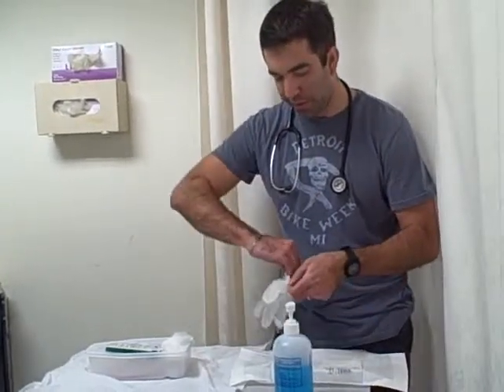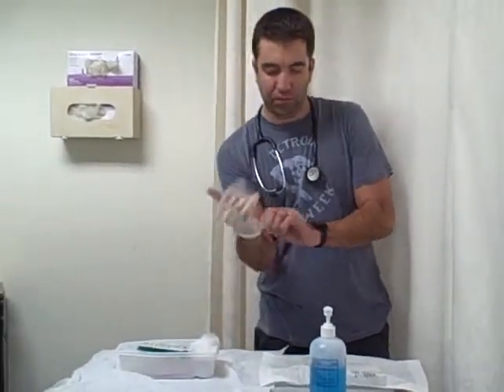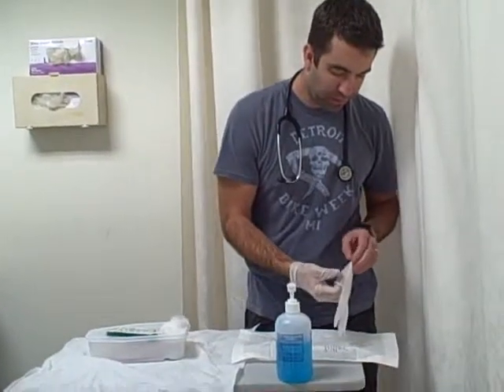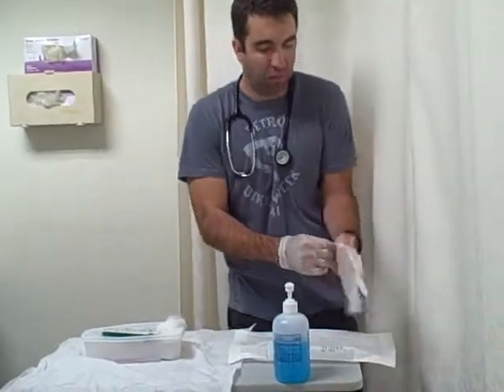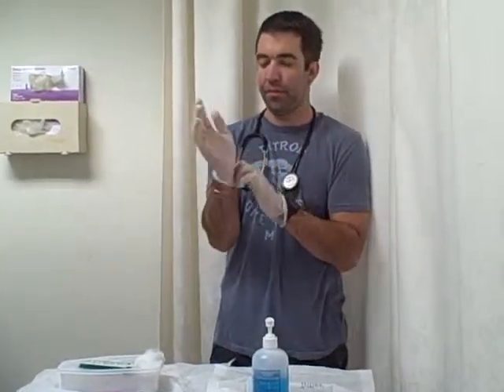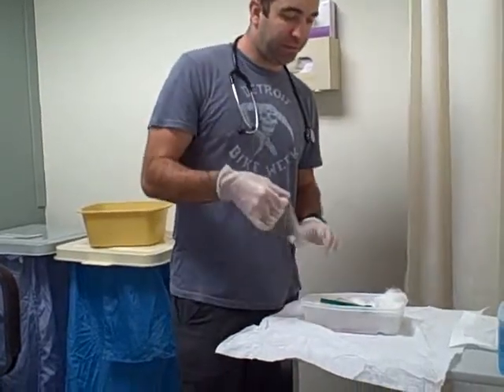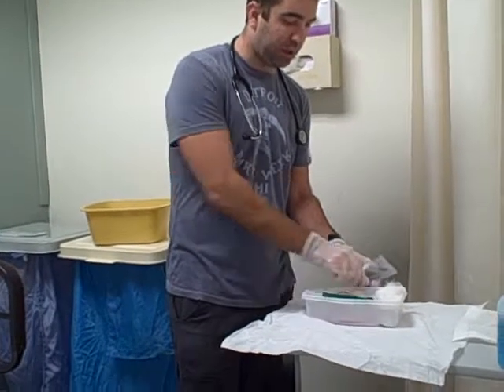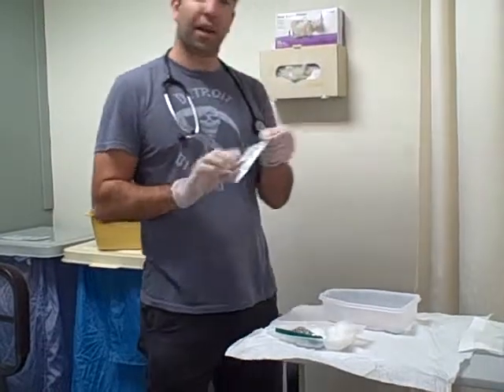I'm gonna put them on the hand first. Sterile gloves are on, so everything inside of here is all sterile. I'm gonna kind of put this to the side here. Put this top section to the side. There we go. And so I've got my iodine prepped.